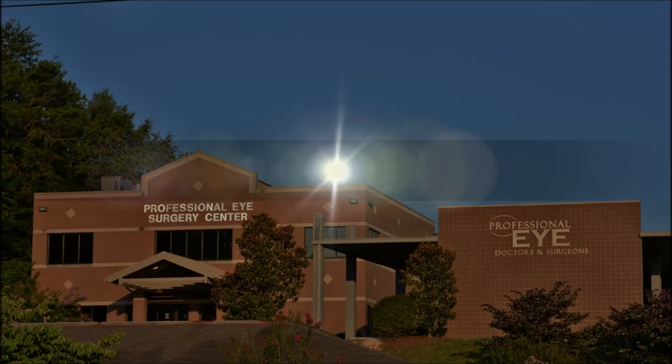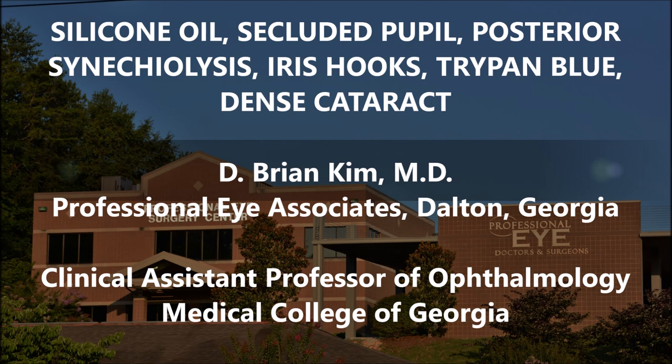This is Brian Kim. I'm going to share with you this case of a patient who had a retinal detachment and subsequent silicone oil placement. This patient also had a secluded pupil. I did a posterior synechiolysis, placed iris hooks, trypan blue, and then performed cataract surgery. With silicone oil, it causes posterior pressure on the posterior capsule, bringing it forward into a more convex position. You'll see how I'm able to disassemble the lens and do the cataract surgery safely in spite of the silicone oil.